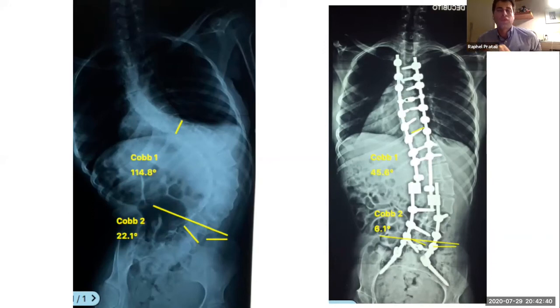You mean put the rod in the iliac? Yeah, it's the technique that was described. It's like a very special rod. It's a U-shaped rod. It's only one rod that does the two sides, convex and concave. And at the distal end, it's like the S2 screws, but it's connected to the rod and it goes straight. It's just in the iliac wings. Except that the rest of the spine is instrumented with sublaminar wires, and putting the spine to the rod is a little bit easier in this kind of patients.